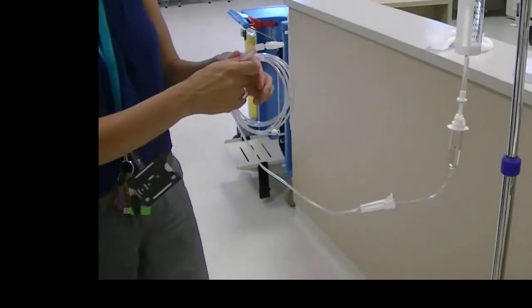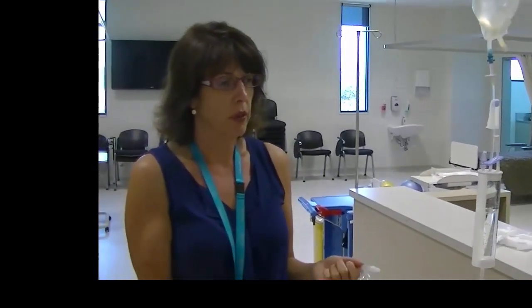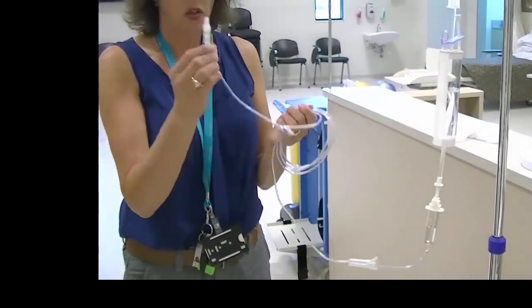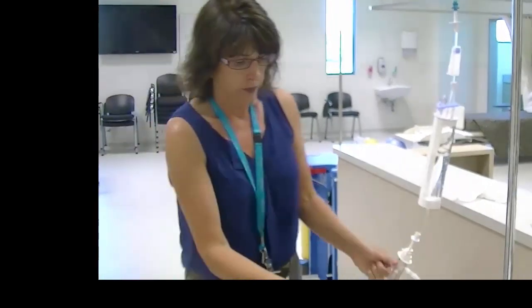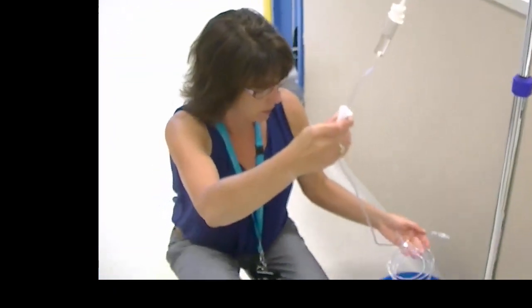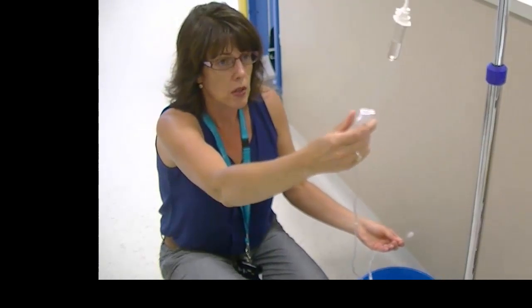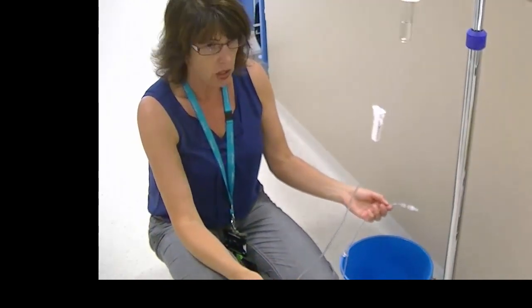Now I need to prime into something. You do not prime into the bed or onto the floor. You prime into a sink or into a bucket or into a bin. But again, you do not drop the end of the IV line into that receptacle. So I will hold it. So I'll just turn it on to let the fluid run down the line. And be patient.